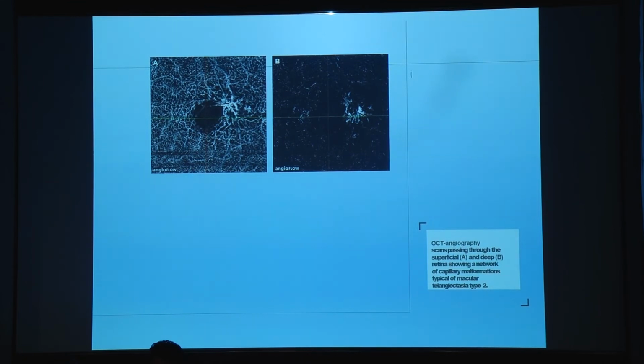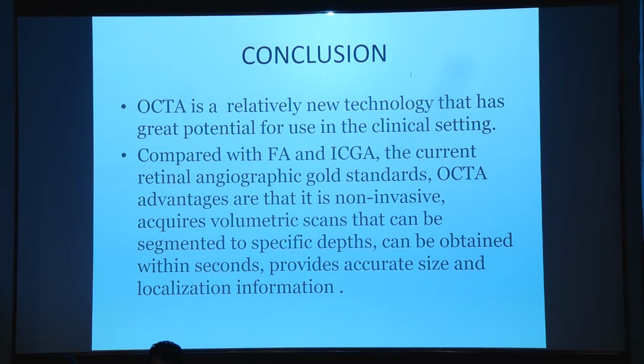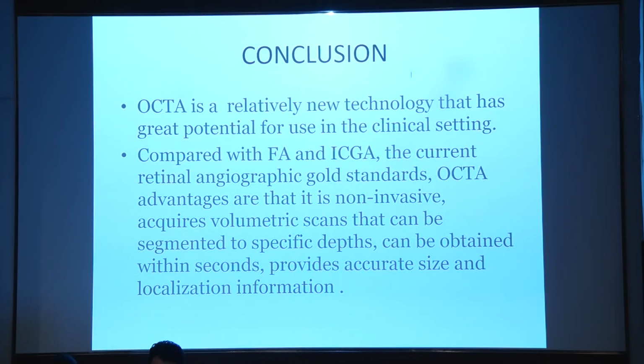So this is a useful tool, but the drawback again being the cost of the device, but hopefully in the years to come, the cost is going to decrease. There is a definite need for OCTA in our clinical practice. It's a new tool with a great potential, and compared to FFA and ICG, which are the current angiographic gold standards, OCTA has an advantage of being non-invasive.